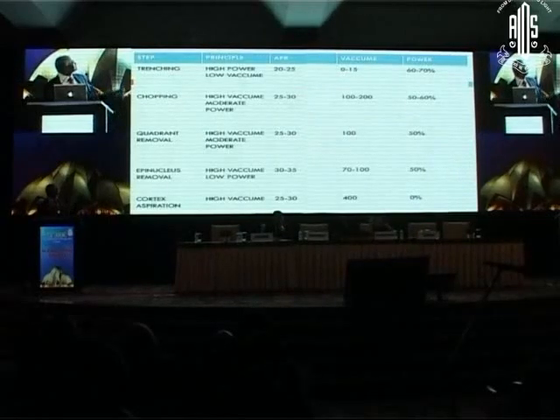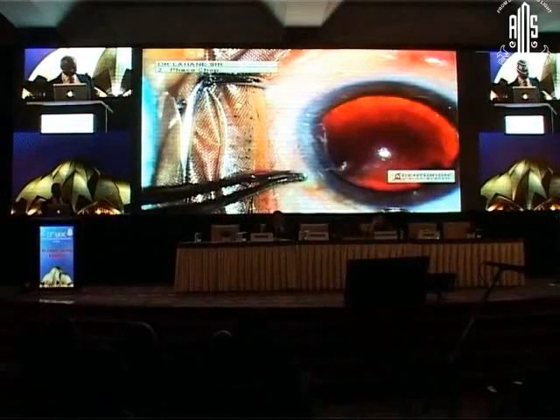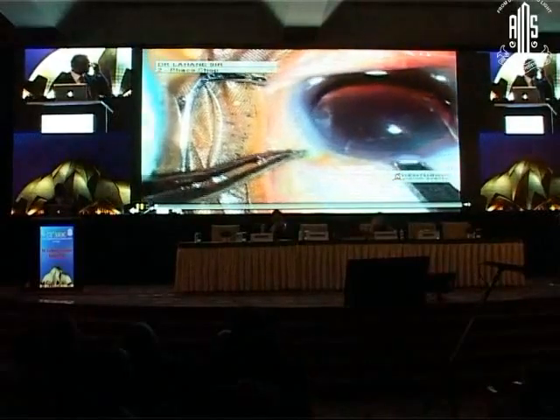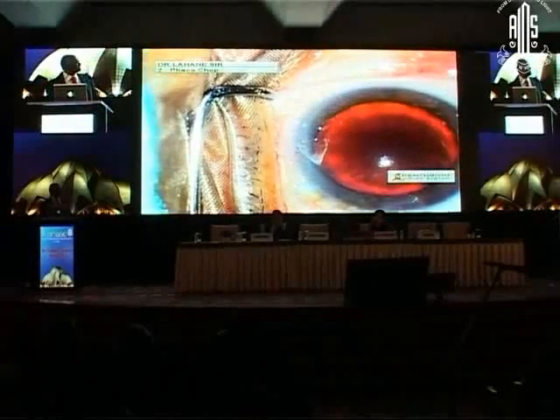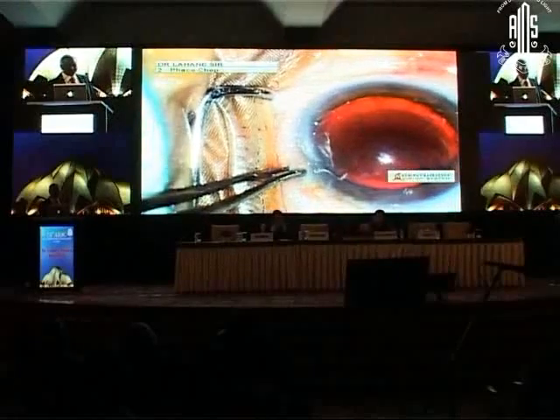So this is what I mean, that newer technologies are there, and I will just go through one video. See now this. I am operating on the Centurion machine and I want to just show you, but the parameters are not seen here.